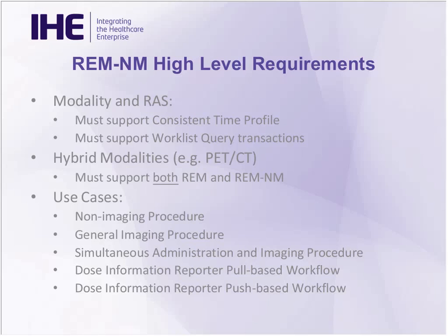So we'll just go through a couple of use cases and high-level requirements here for the modality and the RAS. One of the things that's important with activity reporting is the time component, since these are radioactive and they're decaying. Some of the radiopharmaceuticals have a short half-life. So we added consistent time to both the PET and the nuclear medicine IOD, and then the RAS can participate in the reports.